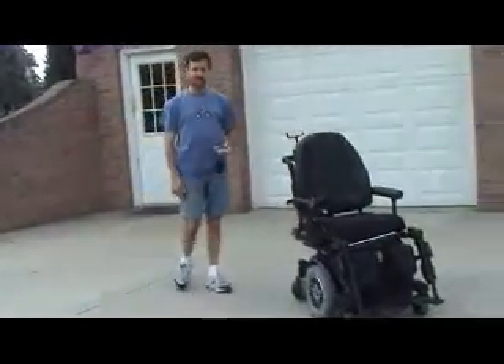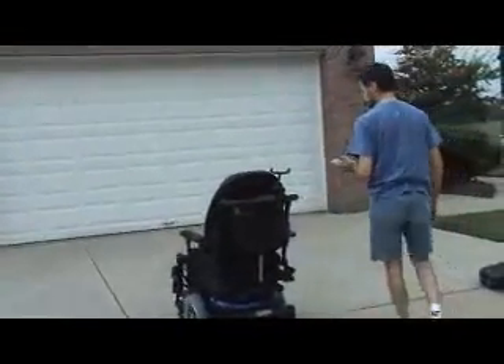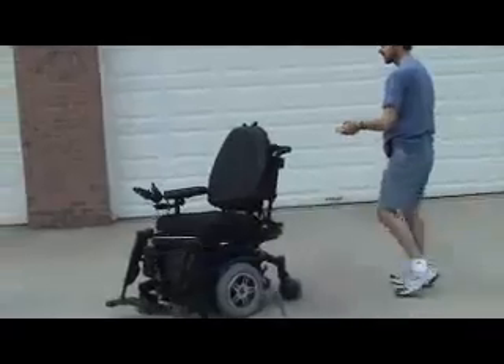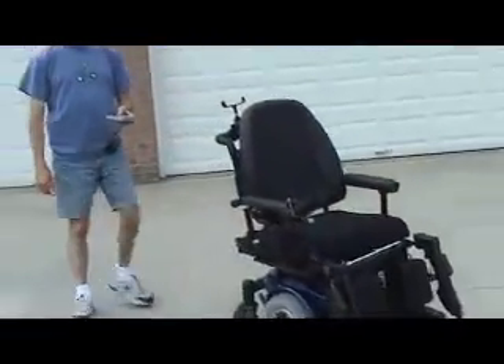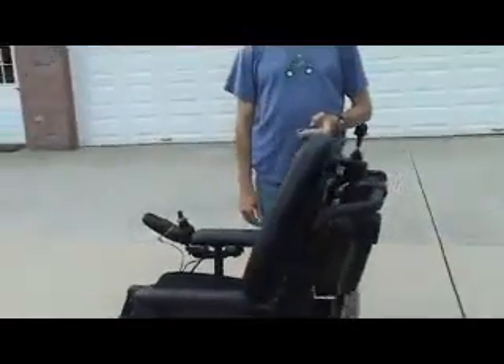Now you can see the chair is going straight. I'll hit left — now it's looping around to the left. Straight. Right. And there we have it. Thank you.